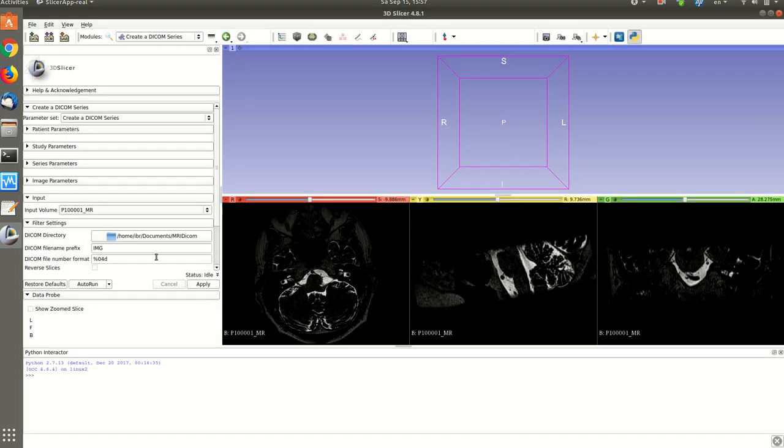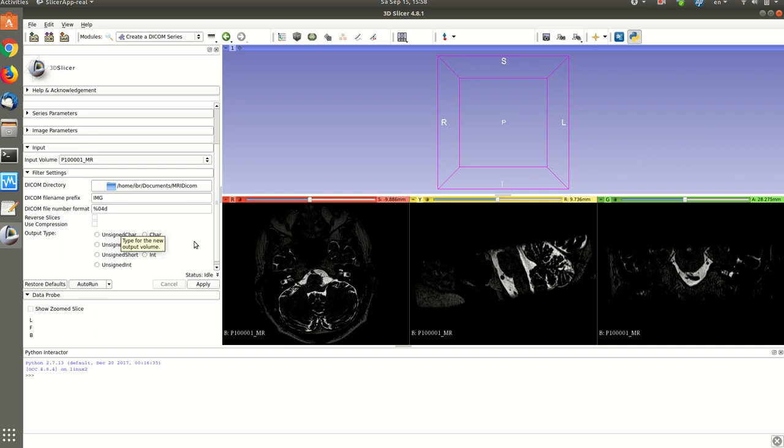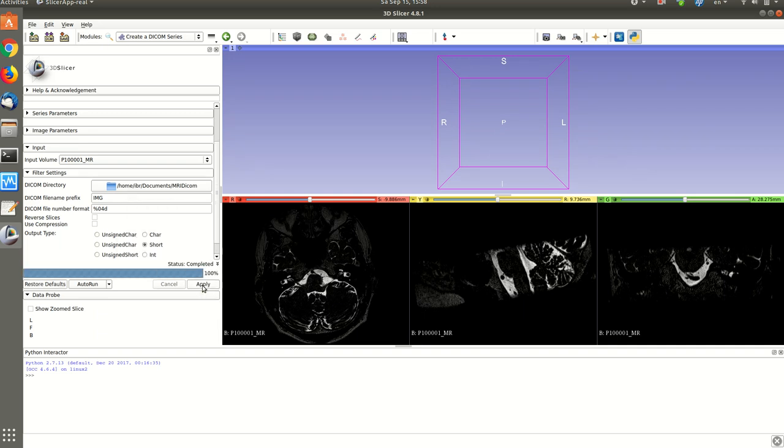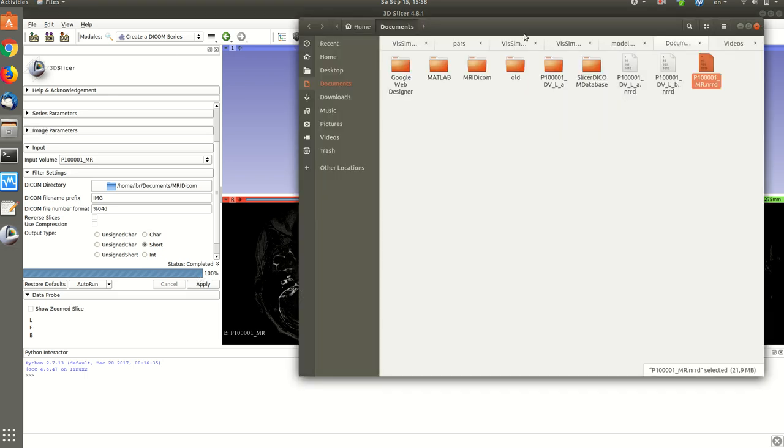You can keep the default parameter or you can change them as you like. After you finish, you click apply and in a few seconds you will create the DICOM folder.